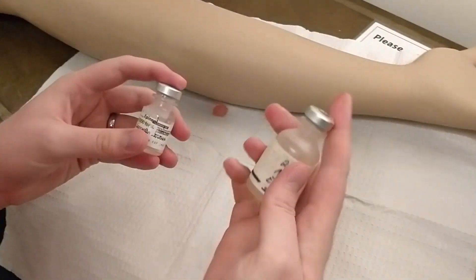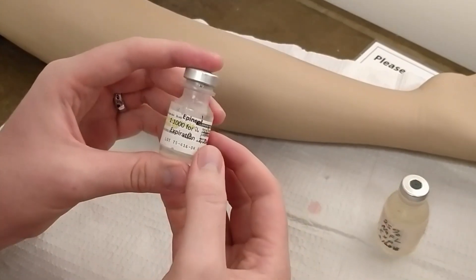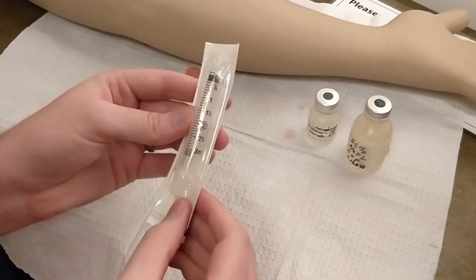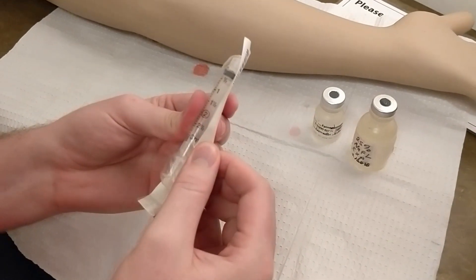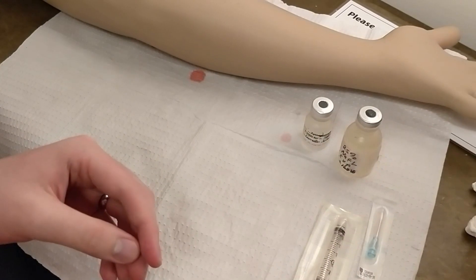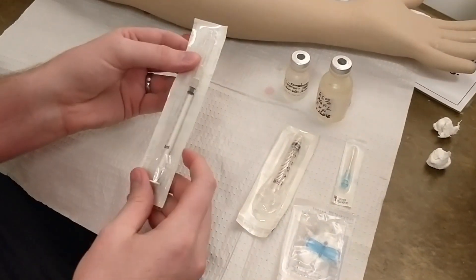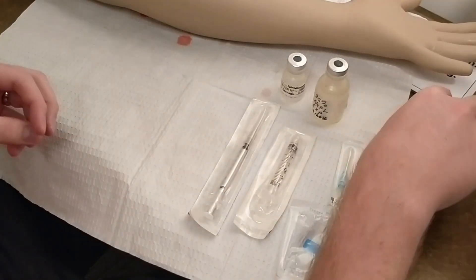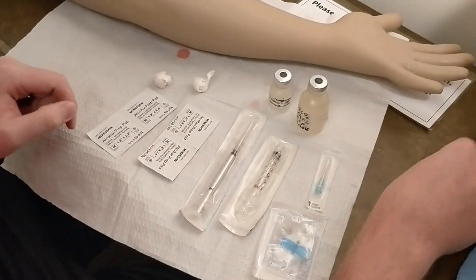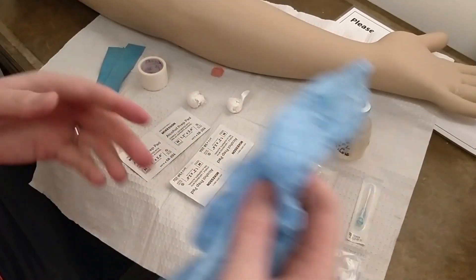First thing we are going to put on here is our medications — make sure you get the right ones: 25% sodium fluorescein and 1:1000 epinephrine. Now get our syringes: for sodium fluorescein, a 3ml syringe, a needle, and a butterfly needle — make sure everything is fully on the drape. Also our syringe and needle for epinephrine, 2 cotton balls, 4 alcohol pads, tape, tourniquet, and gloves.